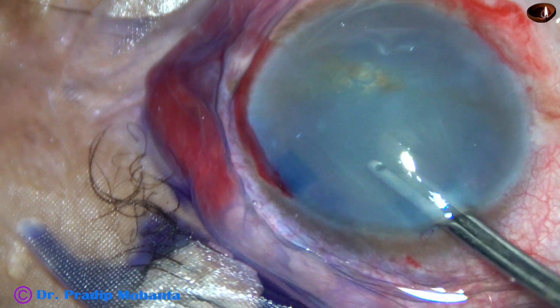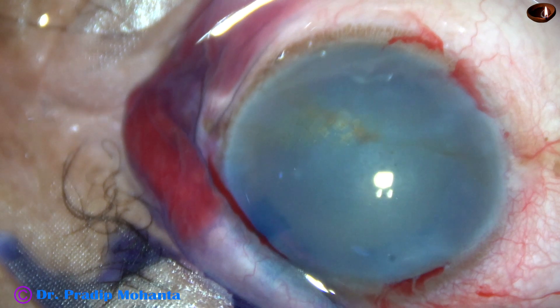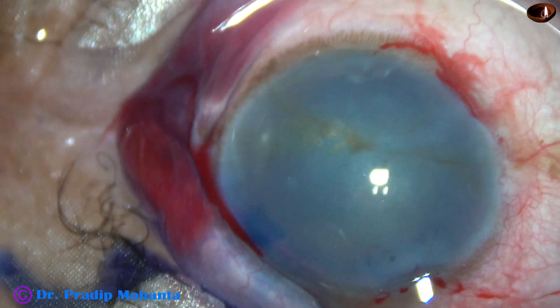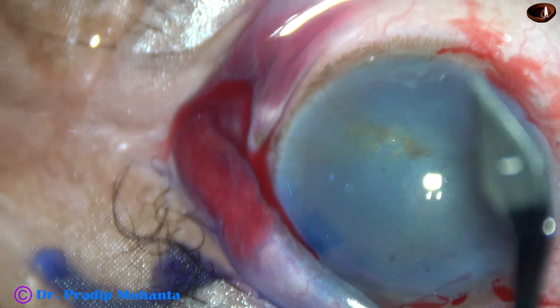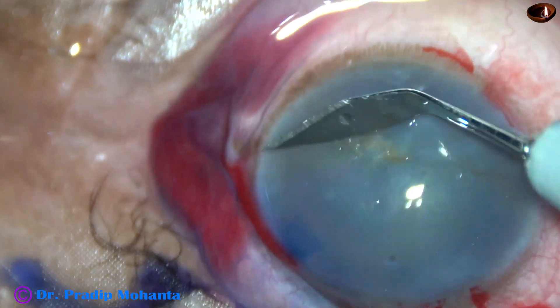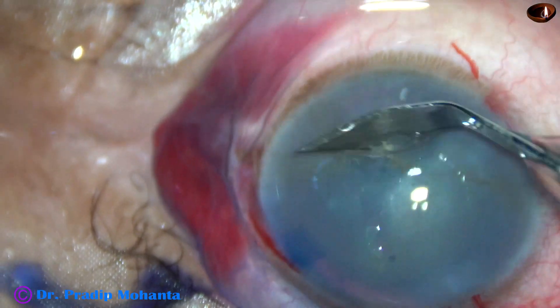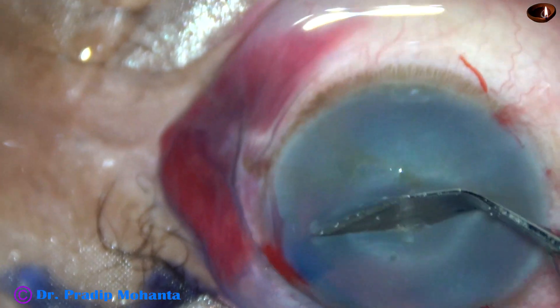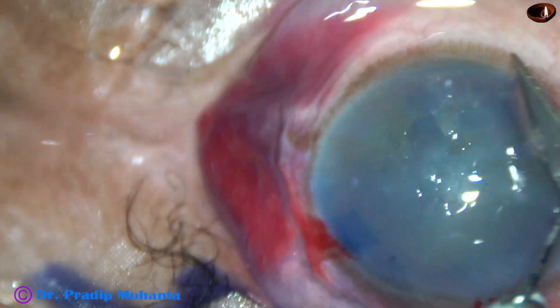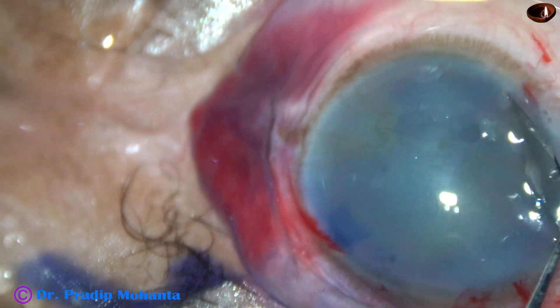But visibility is very poor. What to do now? I have an idea — I want to remove the corneal epithelium and let us see if it improves visibility or not. So I have taken the keratome and by the sharp edge of the keratome, I am scraping out the corneal epithelium. It is going to take some time.